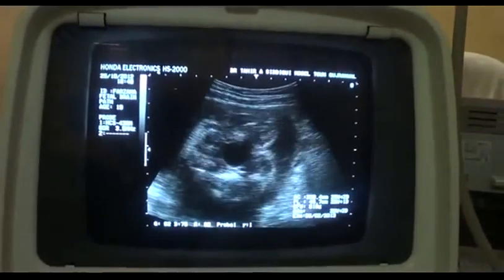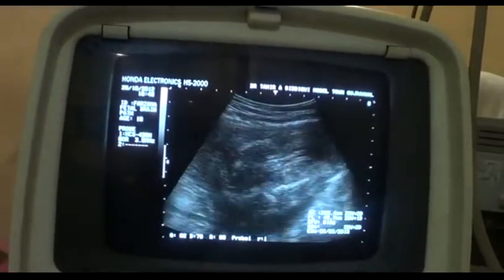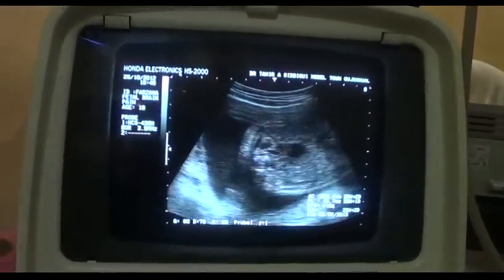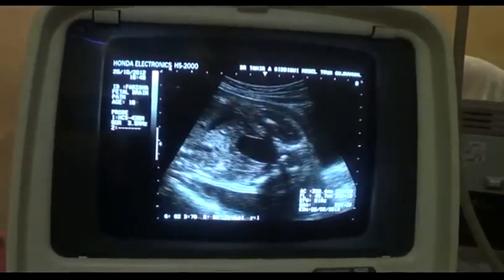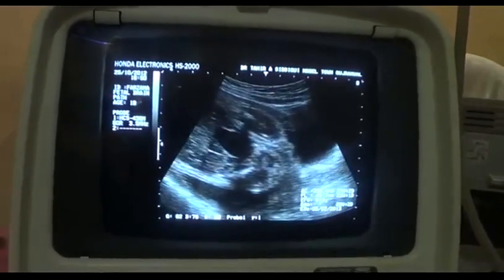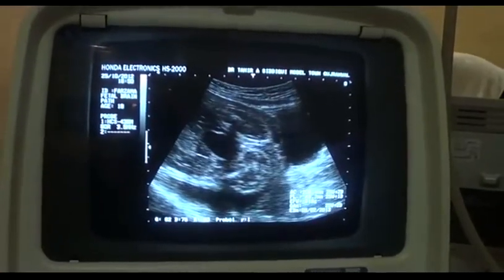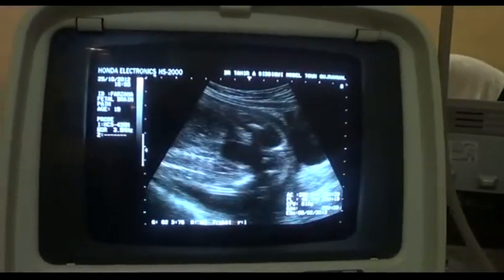Now I am moving the probe very fast. Probably I am in a hurry, yes I am. It's about 10 hours straight of my working. And this video I am making intentionally for learning purpose, to be uploaded on YouTube. As you know, I am Dr. Tahir at Model Town Market, Gujranwala. Tahir Lab Ultrasound Clinic.